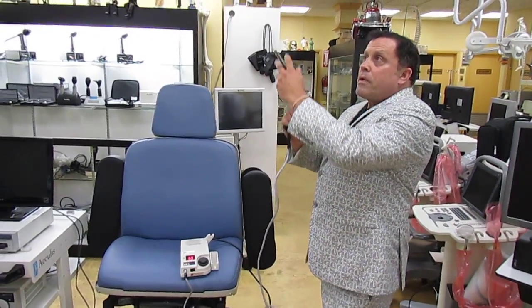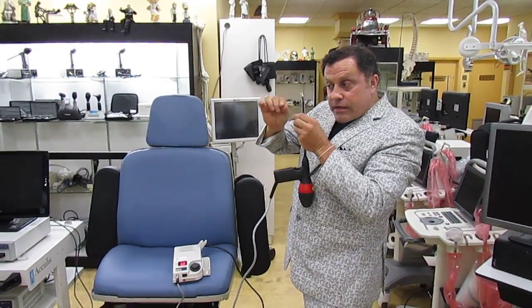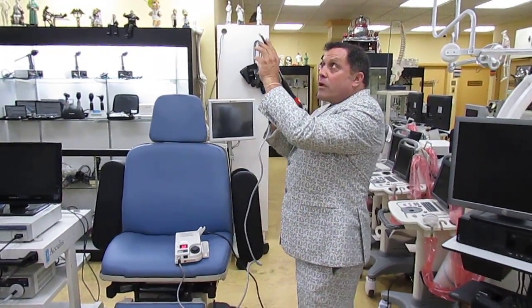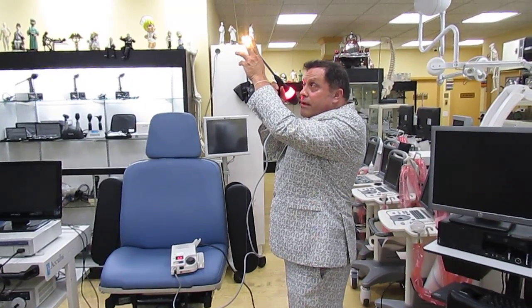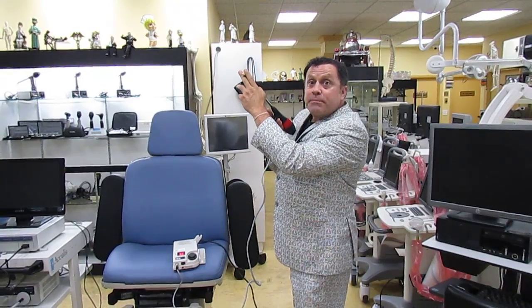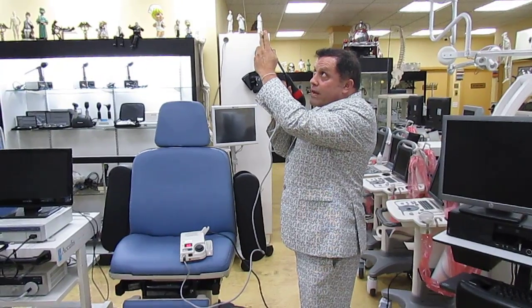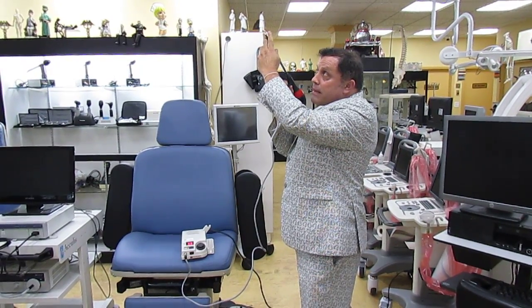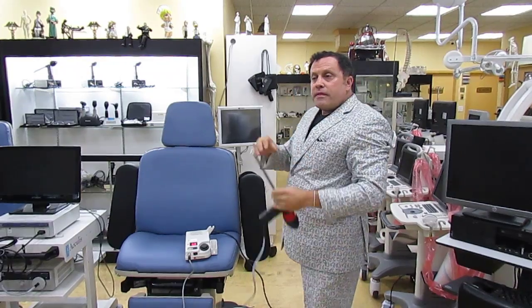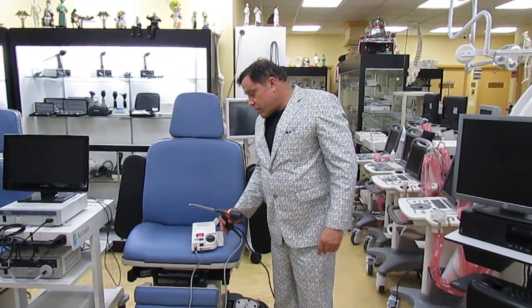You go right above the hemorrhoid — since everything flows downward, the hemorrhoid hangs down, so you target the top. Holding the device there coagulates and stops the blood flow to the hemorrhoid. You apply it once, twice, maybe a third time, and within a few days the hemorrhoid falls off and it's gone.